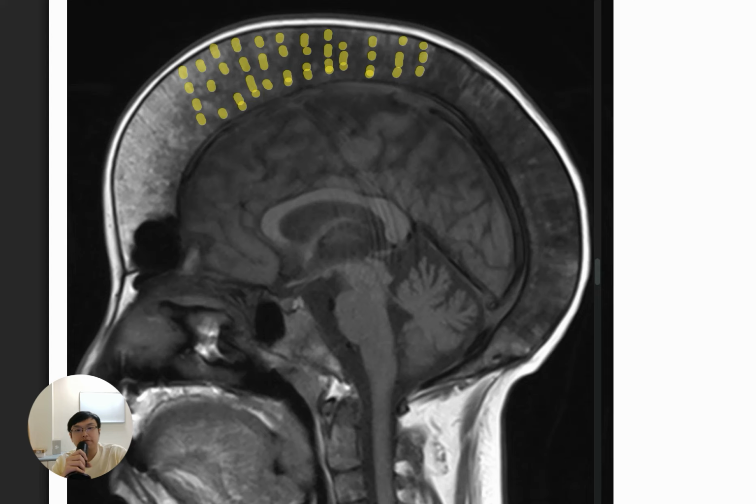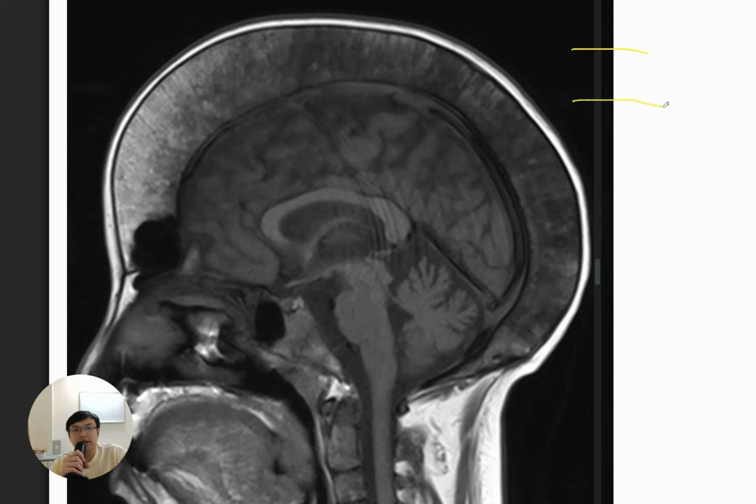This is actually a radiograph or CT finding that you will always come across whenever you are studying Thalassemia major. So let me explain the underlying pathogenesis. And in fact, it is also seen on MRI, because thickened trabeculae you can see in any modality. Okay, so assuming that this is the cortex of the bone, and within it is the medulla.